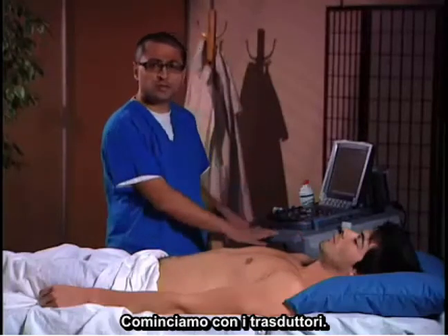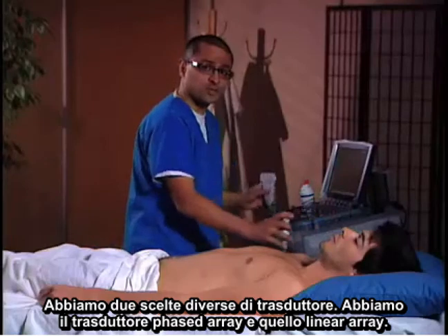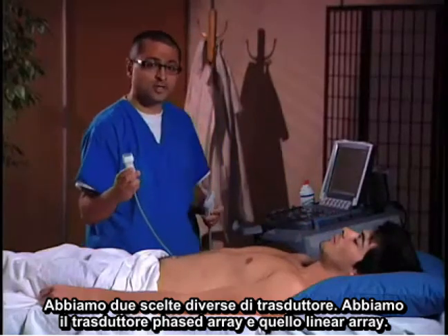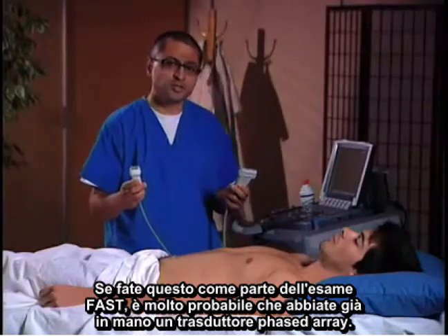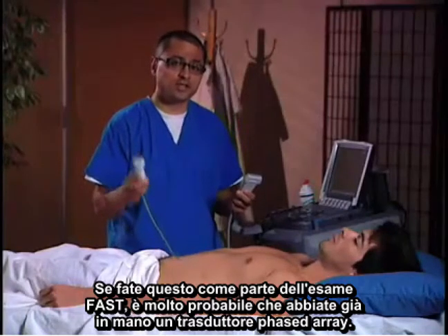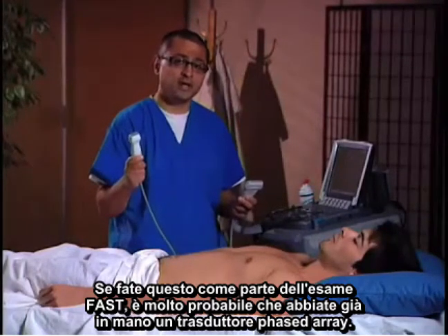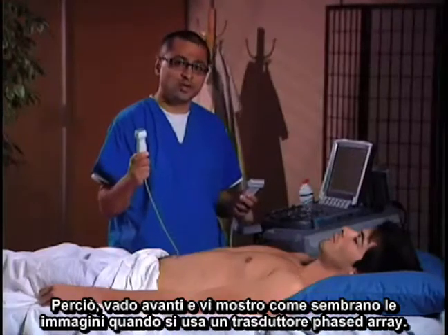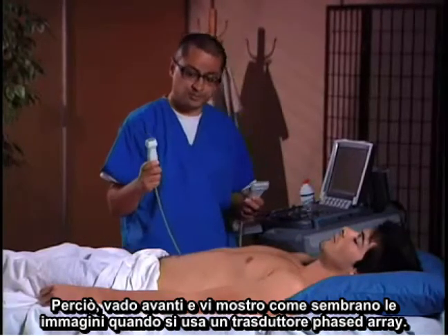We're going to start with our transducers. We have two different choices: our phased array transducer and a linear array transducer. If you're doing this as part of the FAST exam, most likely you already have a phased array transducer in your hand, so I'm going to show you what the images look like using a phased array transducer.